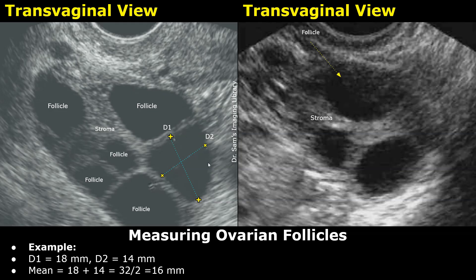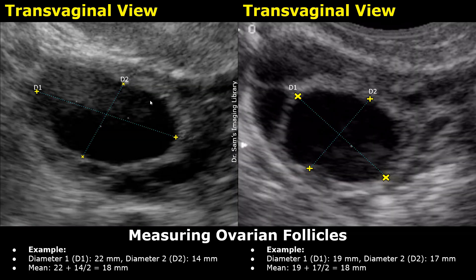After measuring this follicle, you can measure the other follicles one by one in a similar manner. Our next example shows a dominant follicle with D1 measuring 22 millimeters and D2 measuring 14 millimeters. The mean diameter is (22 + 14) / 2 = 36 / 2 = 18 millimeters.